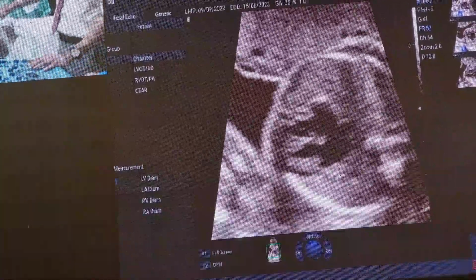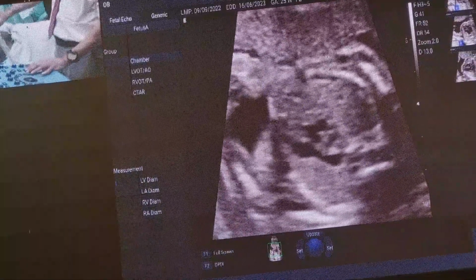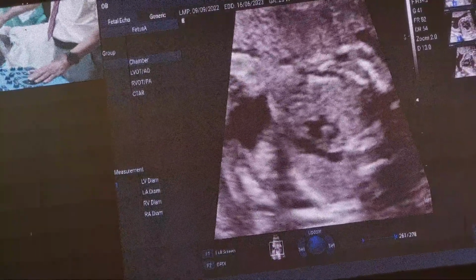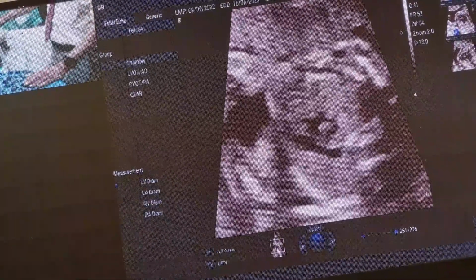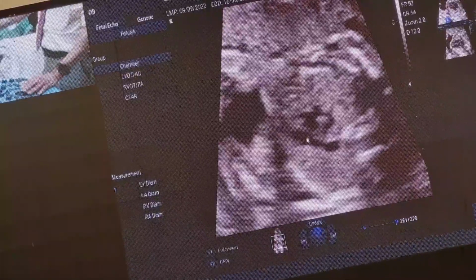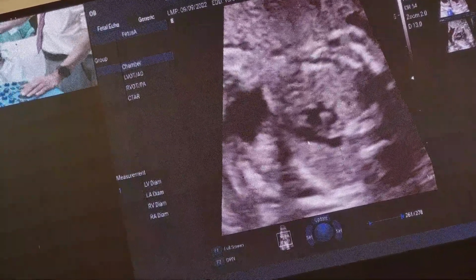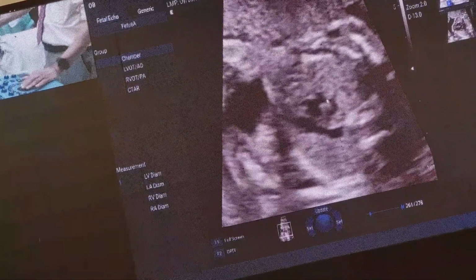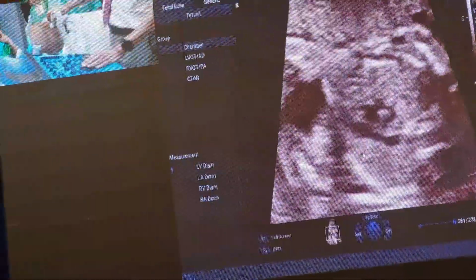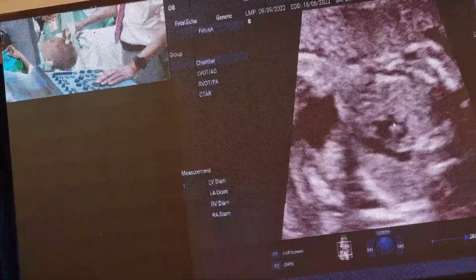So now from the four-chamber view, I'll come up and I see the three vessel view. That's a beautiful three vessel view. We have the pulmonary artery, which is in a longitudinal direction. We have an aorta, which is in a transverse direction, and we have a superior vena cava. From left to right and from anterior to posterior, we have pulmonary artery, aorta and SVC in a descending order of sizes. That is very important. The pulmonary artery is relatively larger, then the aorta, and then the SVC.